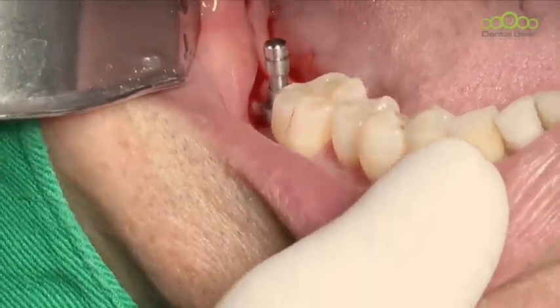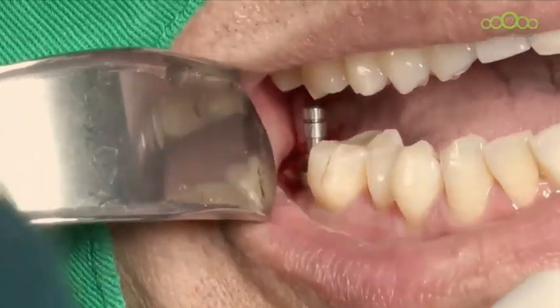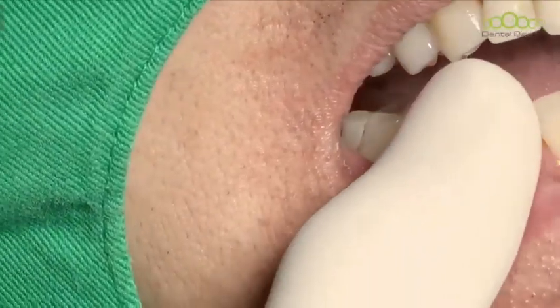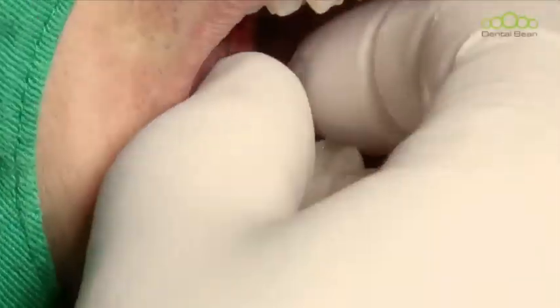When we place an implant at number 7, you must check the path of angulation of the implant very carefully, watching the opposing tooth, okay, like this.